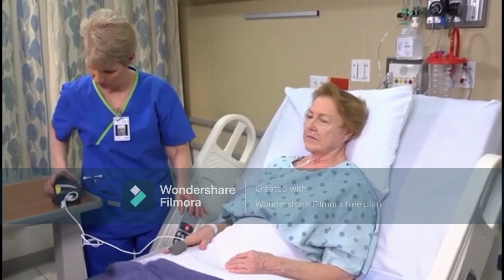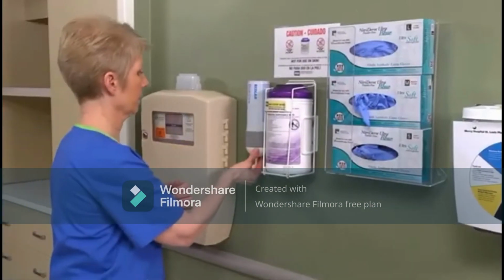When you're finished, perform hand hygiene.